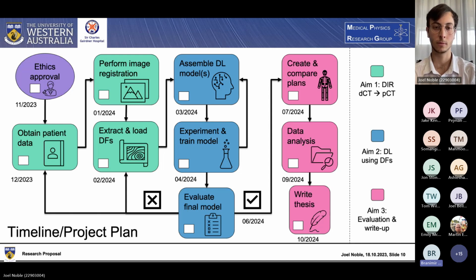So that may be something you want to consider in your inclusion or exclusion criteria for the patients that you select. I'm not saying that the deep learning method would completely not be able to predict the tiny amount of sag resulting from the vac bag, but it may be the case that you'd get the best results from patients that didn't have a vac bag. So that's something to consider.